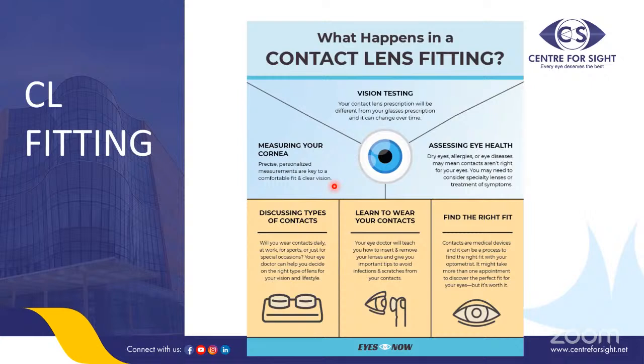For this, the patient's work profile is very important. Is the patient into contact sports? Does the patient want to wear contacts regularly? Does the patient want to occasionally wear contact lenses? Is the patient comfortable? Because it is very difficult for the patient to suddenly adapt to contact lenses, especially when the patient is not motivated.